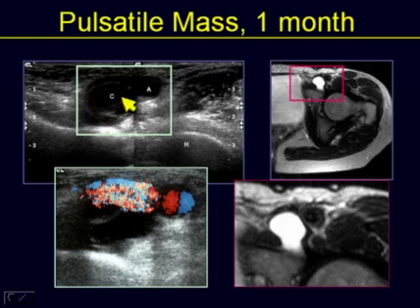However, notice that you can't tell what's going to be the bursitis or cyst, if you wish, against what is going to be great vessels. With ultrasound, one of the great advantages is that you have Doppler. In this case, of course, color Doppler angiography confirms that the upper portion of the hypoechoic abnormality were the great vessels, and the lower portion was the bursa.